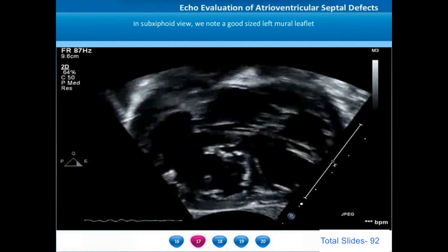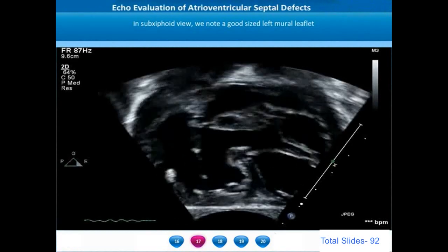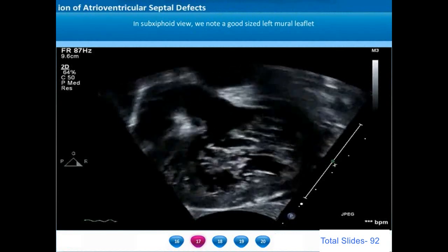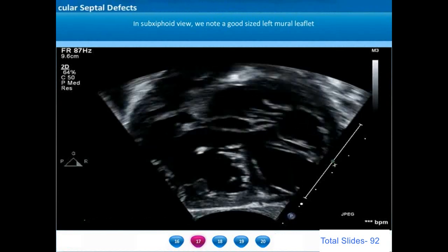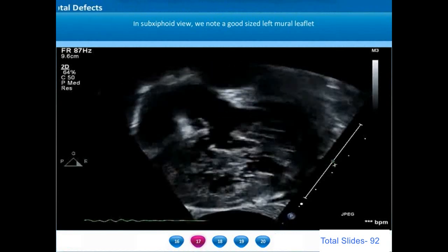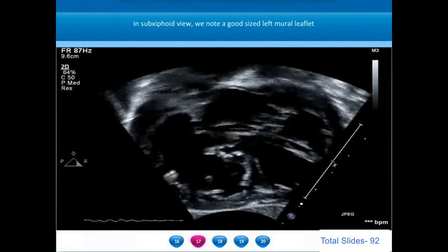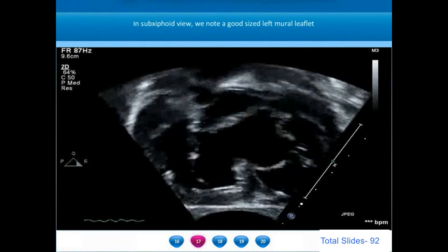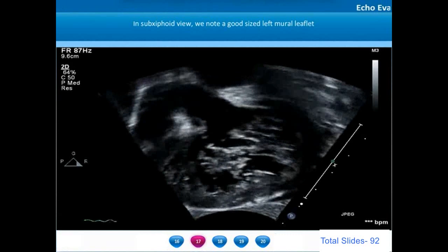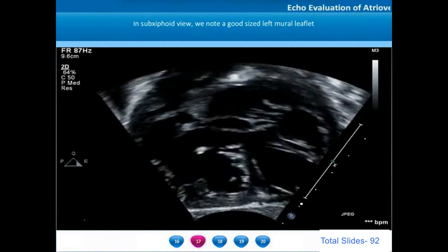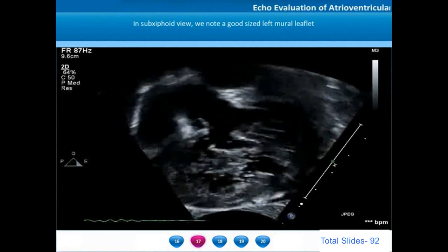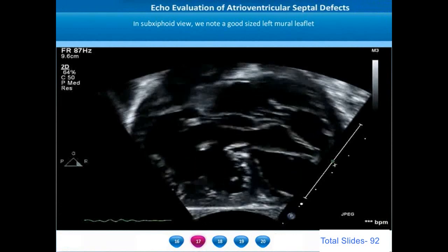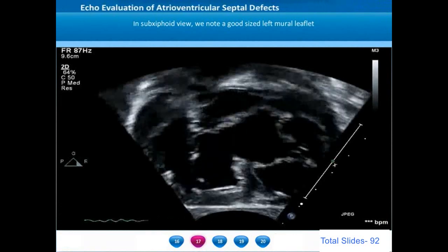This example shows the right anterior and right posterior leaflets also very well. AV valve leaflets are very well formed in patients who have trisomy 21 or Down syndrome. Patients with Down syndrome have large, well-defined AV valve leaflets.